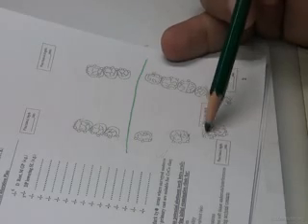I can. If the premolar is strong, I can eliminate even the clasps on the canine. But I could not eliminate the rests. Rests, I have to keep them. Why? This you got in the exam. Why do lingual plates have to have rests on canines? To minimize... No, it's not the indirect retention. The plate itself, by its presence, already provides you with indirect retention. It's to minimize the trauma on the gingival tissue.